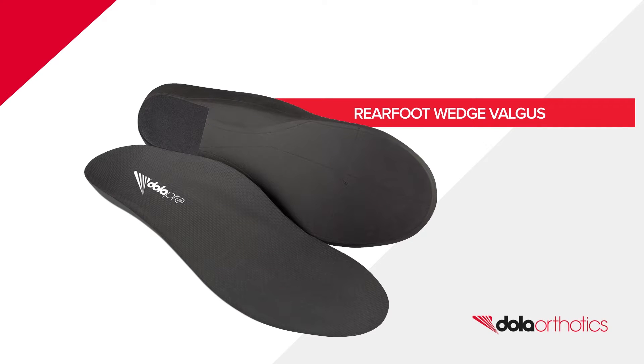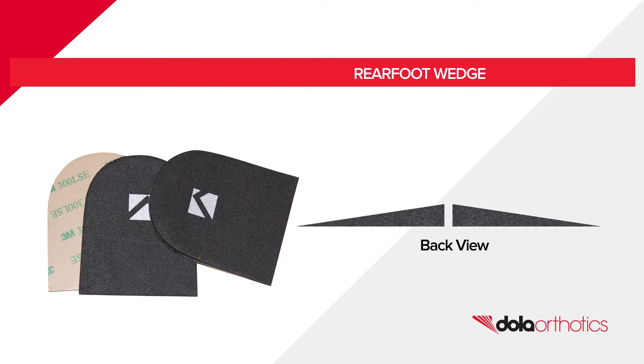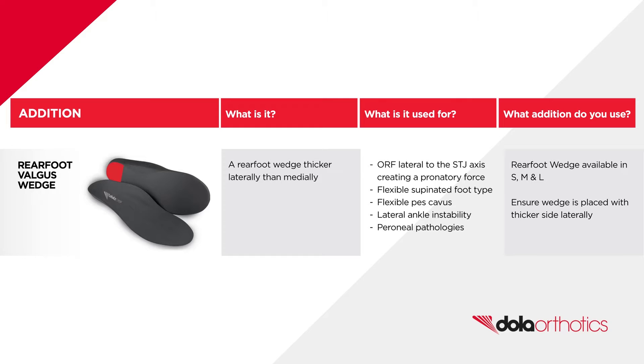Rear foot valgus post. Introducing our Dola EVA rear foot valgus wedges, available in small, medium and large sizes.